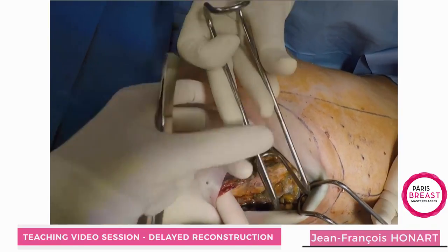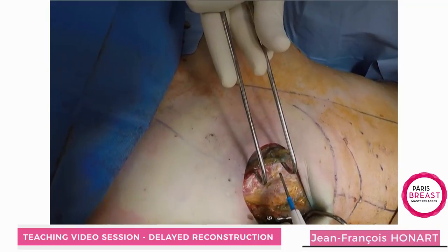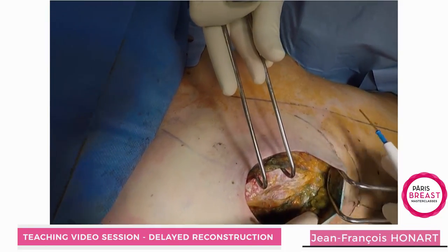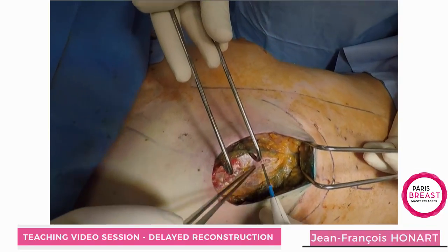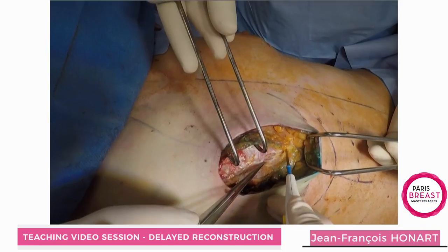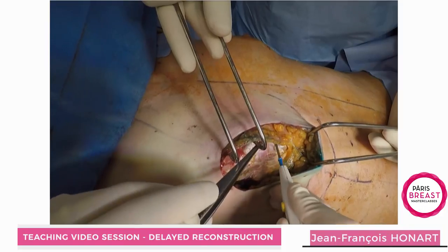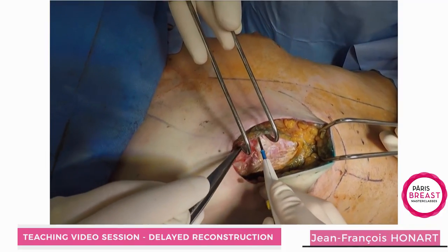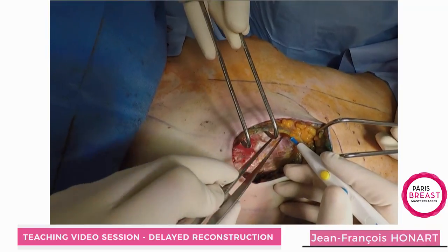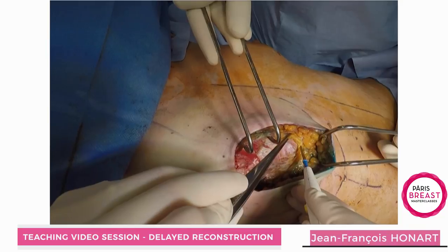This is a classical implant pocket behind the pectoralis major. We will cut all the lower insertion of the muscle, and by doing this we will create sufficient space to put the expander.